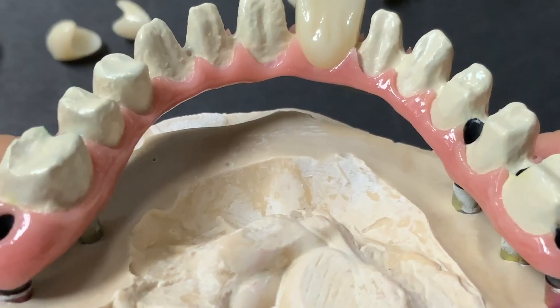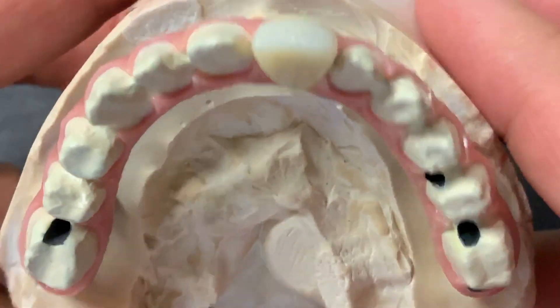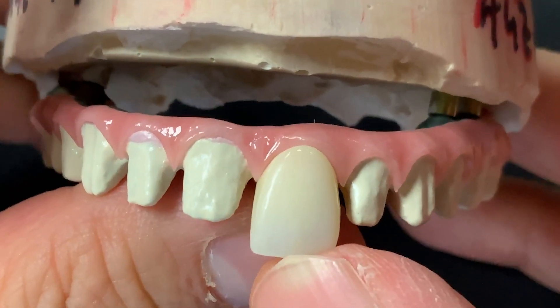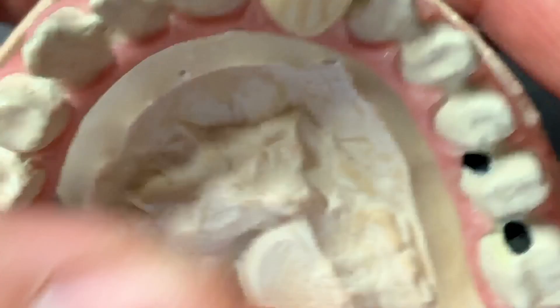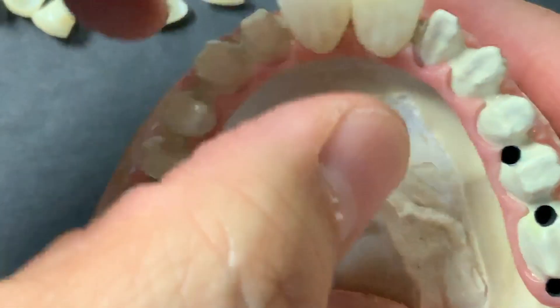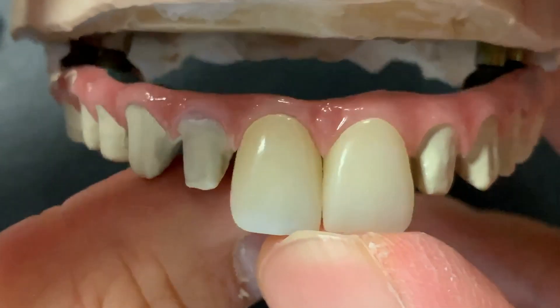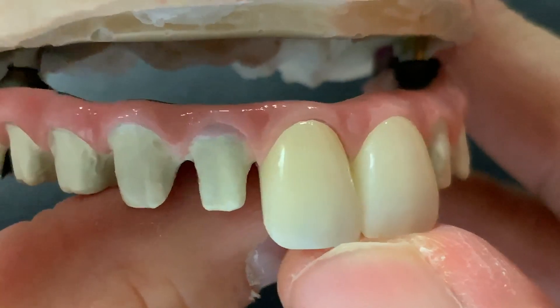It's a long journey. I call it — this is maybe like building a big house. This is the final, what it looks like. You can see the closer view. So we make this one single restoration, and the other one, we just got the second one — great, just a little bit layered, almost monolithic.